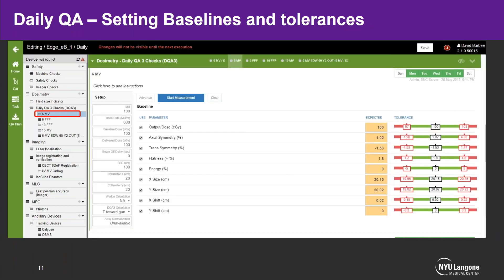In the setting baselines and tolerances workspace for daily QA, we have safety checks, dosimetry utilizing the Daily QA3, imaging tests, MLC weekly checks, MPC, and ancillary devices. You connect your device and start a measurement to set your baseline, and you can see your failure and warning levels for everything. This is what our imaging daily registration tests look like, where we perform six-degree-of-freedom tests and enter the rotations and translations we see on our TrueBeam consoles, with expected baselines, warning levels, and failure levels.